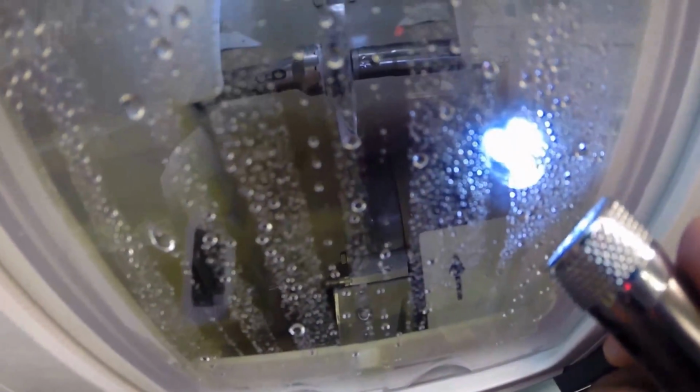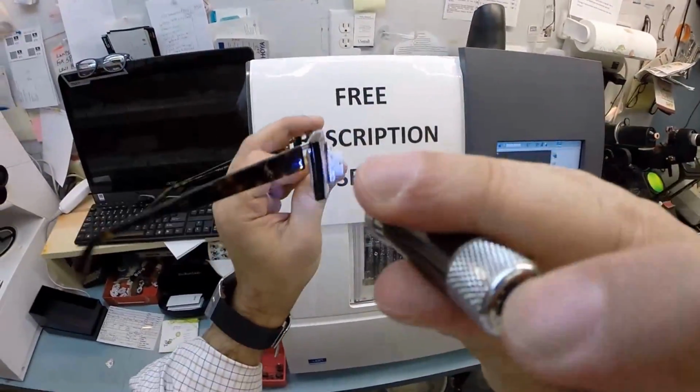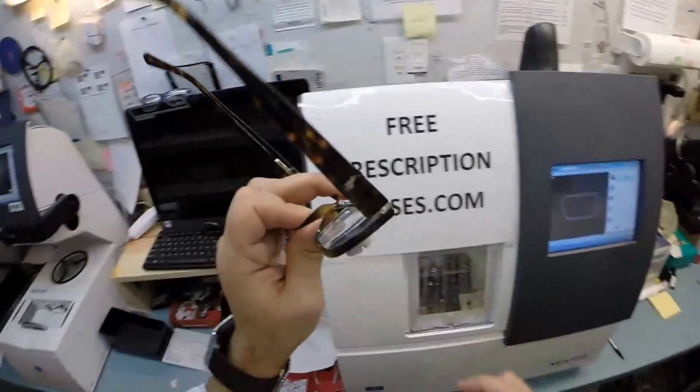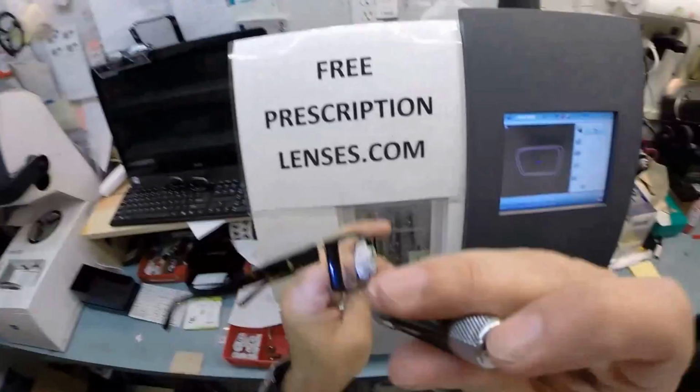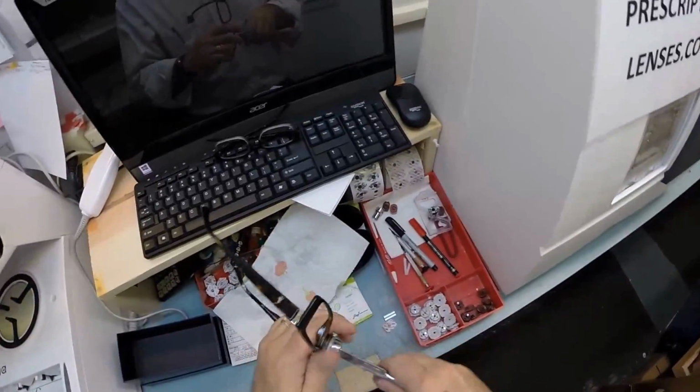And again, just to repeat myself, the reason why it does it twice, measuring the thickness of the lens at every point, it knows exactly where to place the bevel, so you end up with the best cosmetic value where you had hardly any edge thickness whatsoever, and of course nothing protruding from the front of the frame. So this block is no longer needed. I'm going to go ahead and remove it.